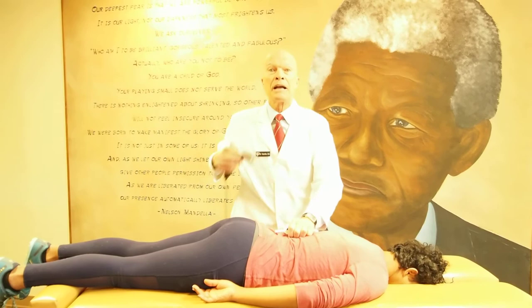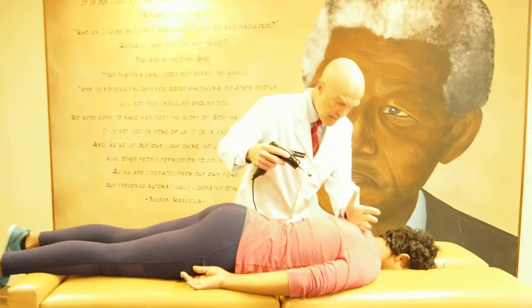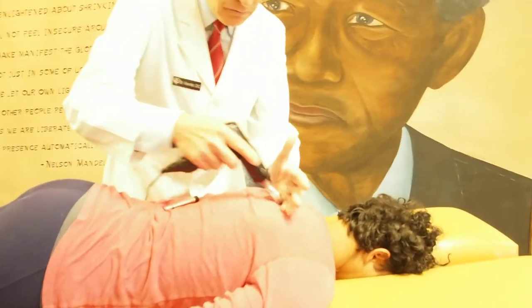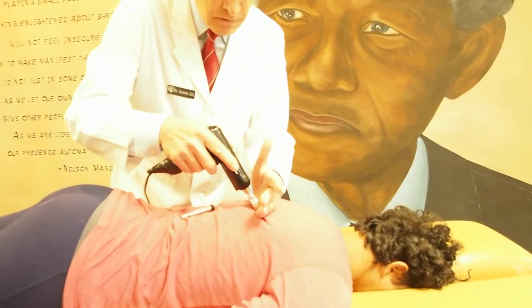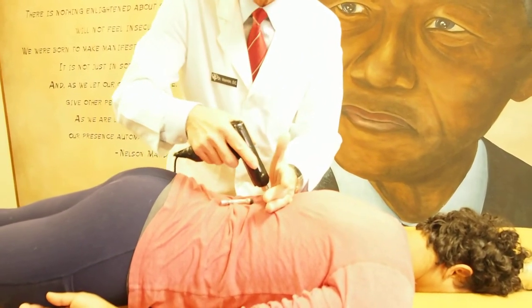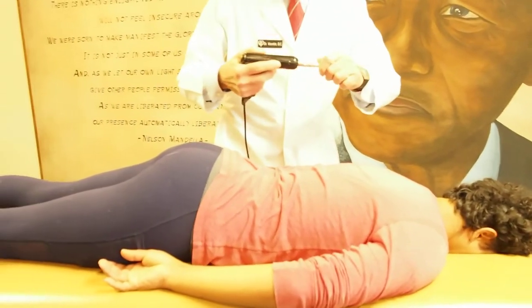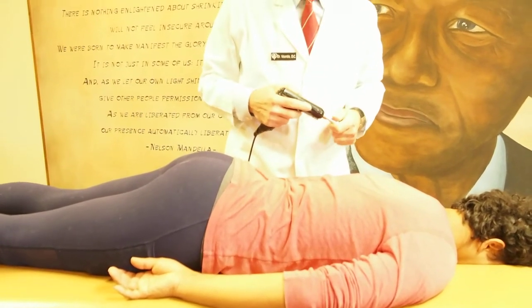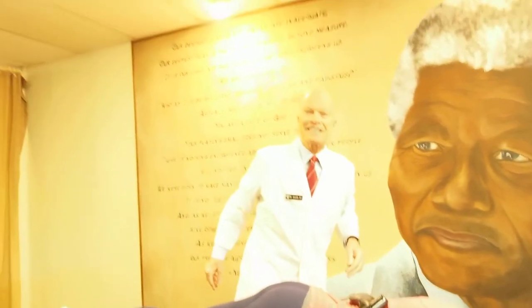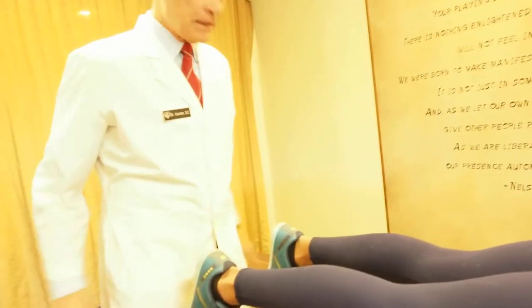I'm working with the instrument to take pressure off the nervous system, aligning the vertebrae — the backbones — and the ribs, and feeling with my hand for vertebrae that are out of alignment or subluxated. Subluxation means bones that are moving too much or not enough, interfering with the delicate and sensitive nerves that control our life and determine how much of our potential we'll enjoy.